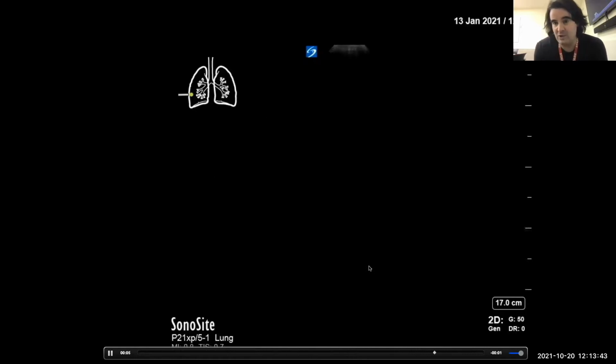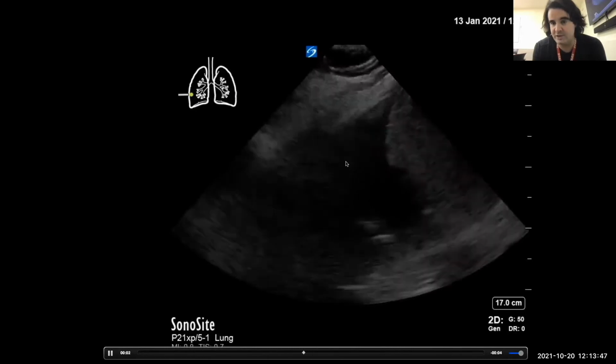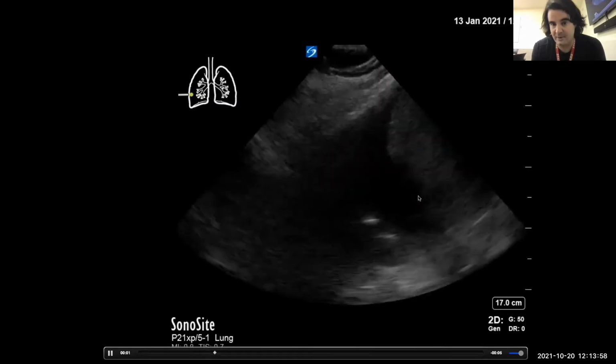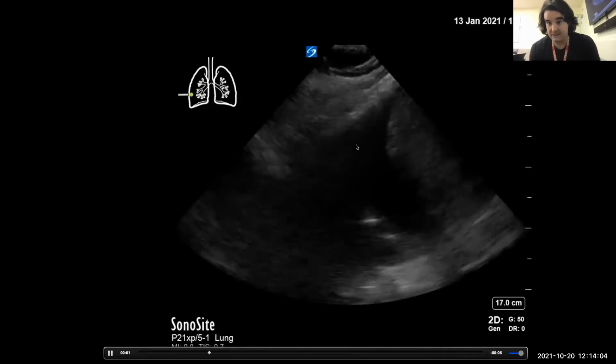So this has resulted in some people calling this the spine sign, which means that there must be a consolidation or effusion here, which gives an acoustic window. So, this almost certainly looks like a pleural effusion. I'd be very careful though to make sure that in fact I am seeing the diaphragm here, because you can certainly have subdiaphragmatic effusions, which can look quite similar, especially if the image quality is not crystal clear.